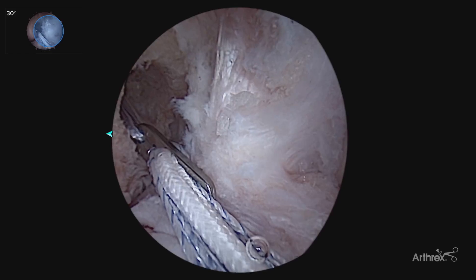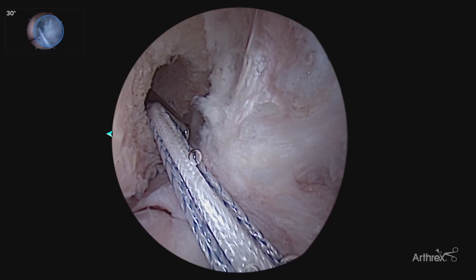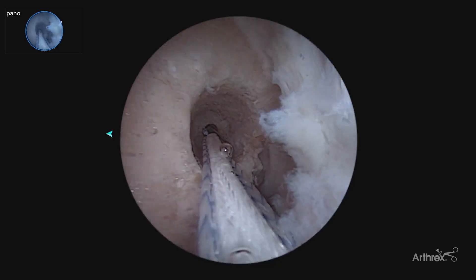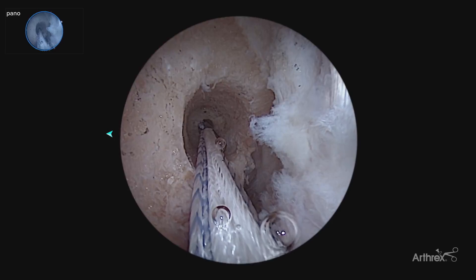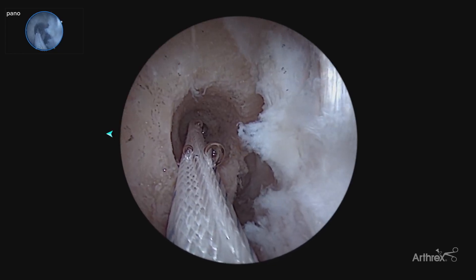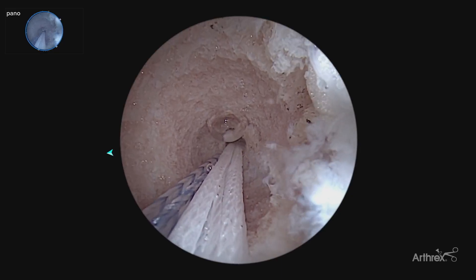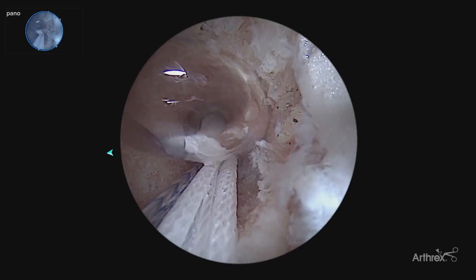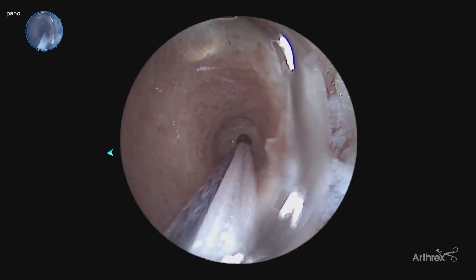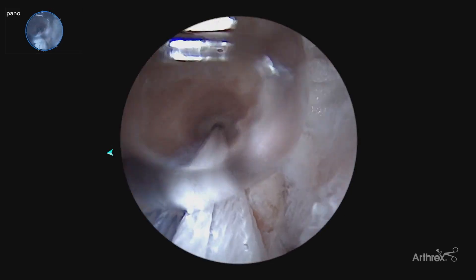Here's our standard 30 degree view of passing our button for our ACL tightrope. With the 30 degree view, we're attempting to look up the tunnel to watch the button flip. By switching to the panoscope, it allows you to look directly up the tunnel with a circumferential view, watching the button pass up the tunnel, allowing for safe visualization of the flipping of the femoral button as we prepare to pass our bone plug. We have dual confirmation — both direct visualization of the button flipping, as well as tactile feedback pulling back to assure that the button has flipped on the far cortex. Referencing our study comparing the 30 to 70 degree scope, now we can see the back wall, assure our bone plug is flush with the back wall — very accurate bone plug placement.